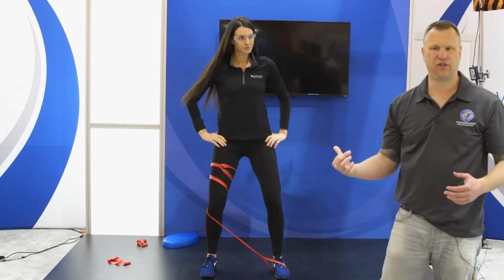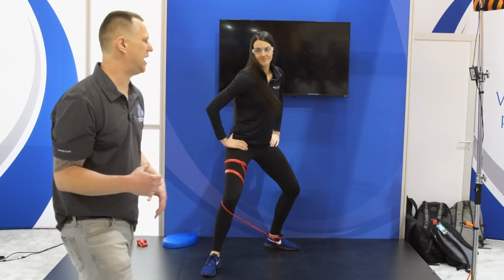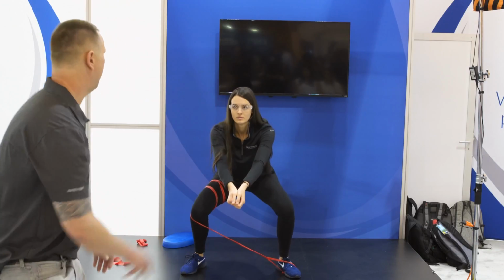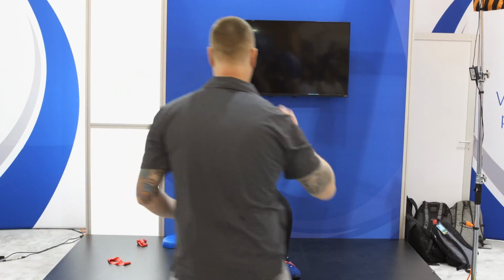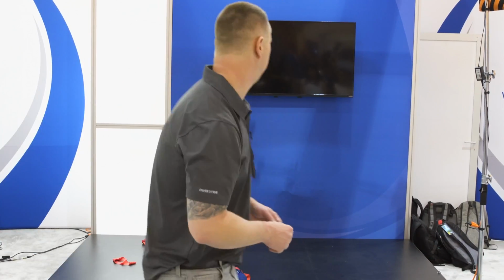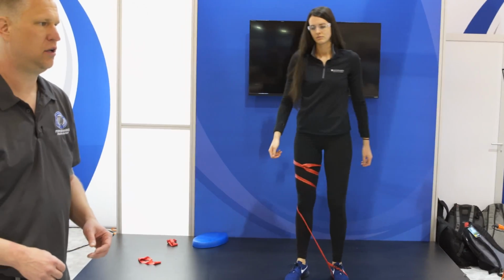What I like about the spiral techniques with CLX training is that if I'm a therapist working on functional exercises, maybe she's a volleyball player. Maybe all of a sudden I have her now in this position, getting ready to bump or set, and I'm tossing her a ball, and she's hitting it back to me. So now I'm tossing, she's hitting it back, I'm tossing, and she's moving side to side. So she's going left, right, and I'm tossing a ball, and she's bumping, hitting, setting, whatever dynamic activity we want her to do, okay?